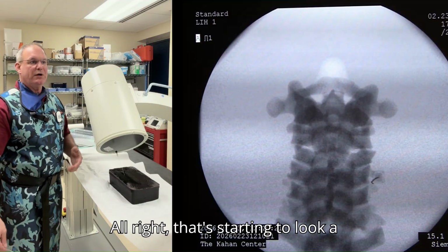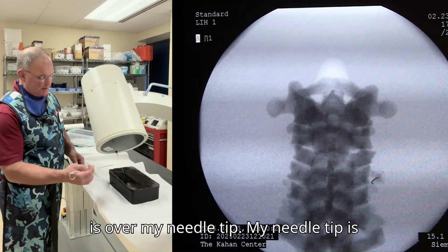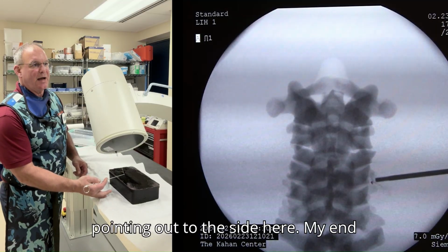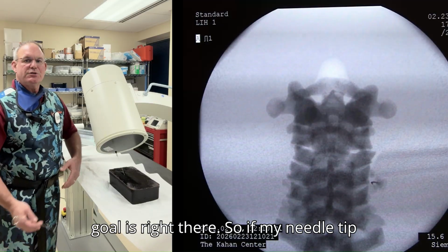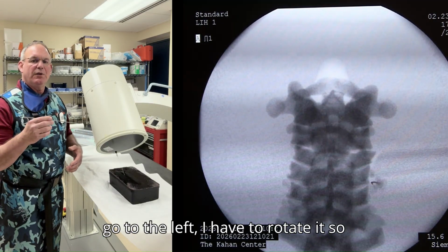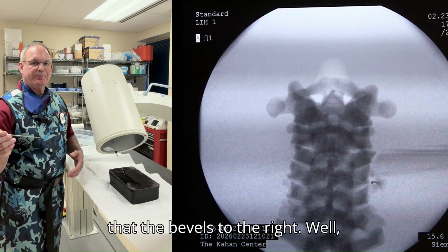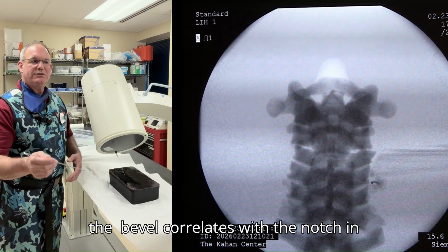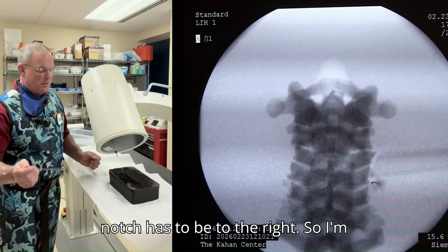All right, that's starting to look a little bit better. As you can see, my hub is over my needle tip. My needle tip is pointing out to the side here. My end goal is right there. So if my needle tip is pointing to the right and I want it to go to the left, I have to rotate it so that the bevel's to the right. Well, the bevel correlates with the notch in your spinal needle. So that means my notch has to be to the right.